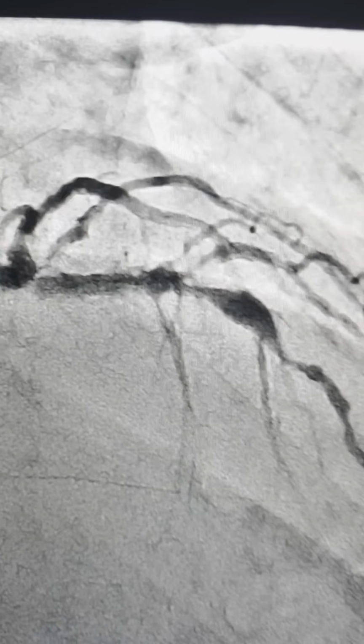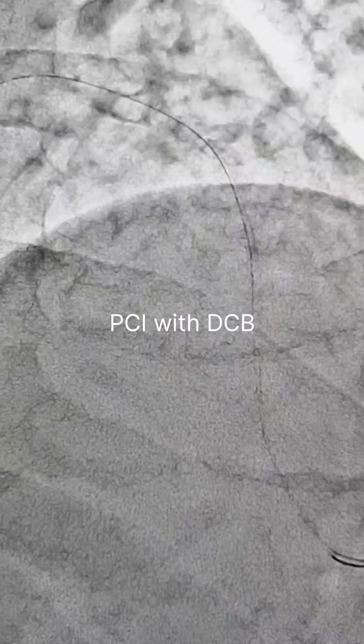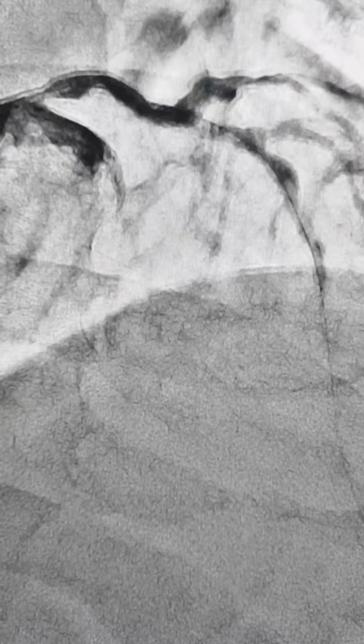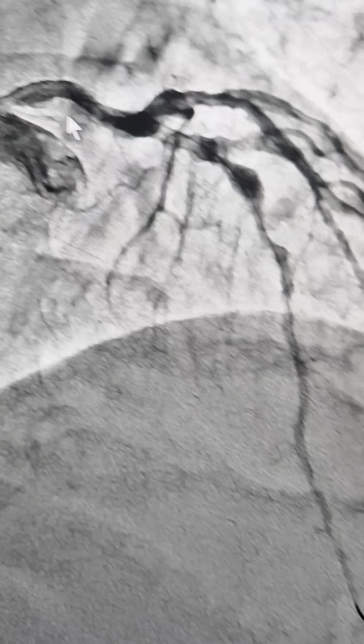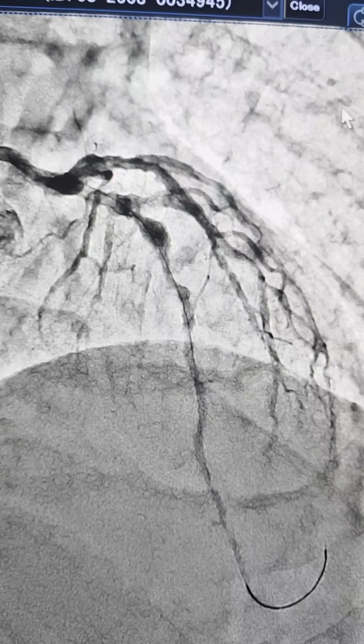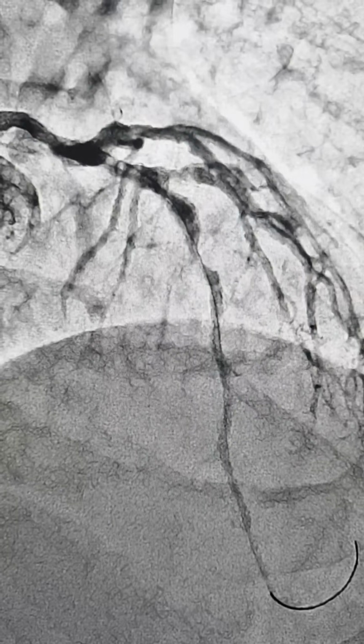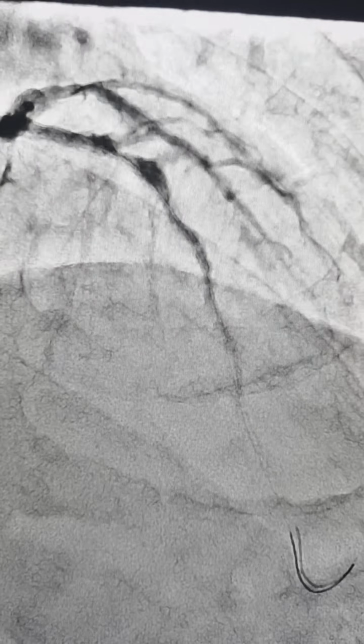So nothing very serious. Went out, counseled. There was a little bit of narrowing in the circumflex ostium, but nothing. There's a lot of calcium around, and we looked at it selectively at the LAD and the left main ostium. Part 2 of this case, the 72-year-old fighter pilot. So we thought, okay, fine. We counseled the family, and they all agreed that we should fix these two narrowings and leave the rest on medical treatment in this relatively asymptomatic person with just a high calcium score and one episode of chest pain. So we did balloon it, and the balloon opened up well.